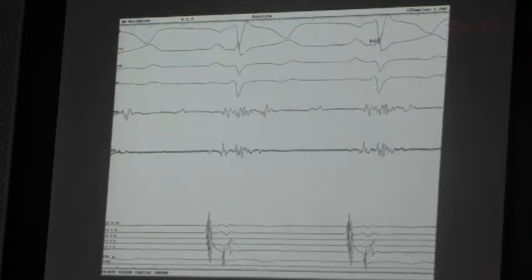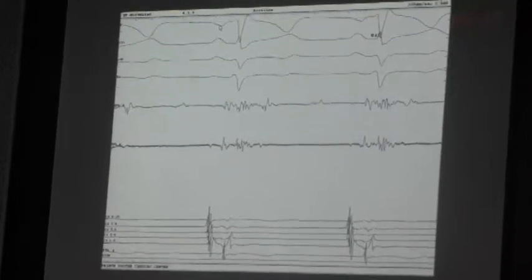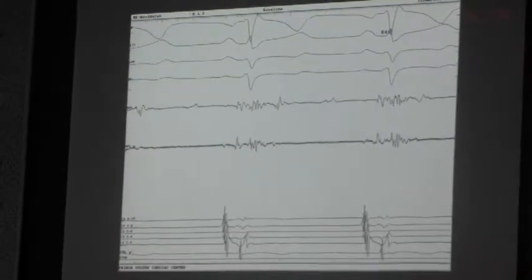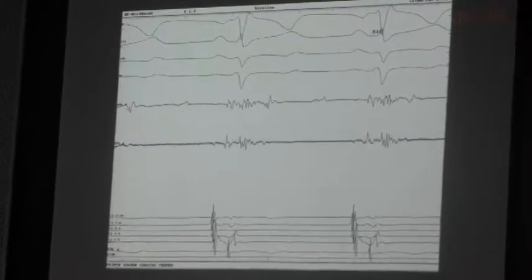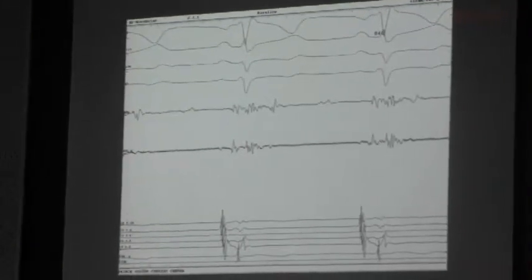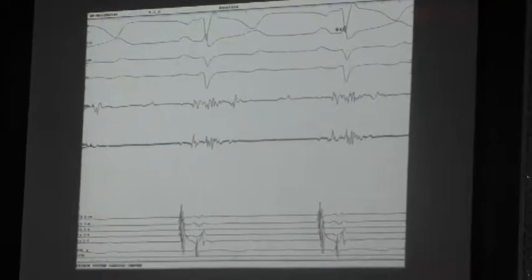One observation in this ECG tracing is that you see the P wave is inverted. This is not normal. We have a training program for the EP tech, and this is one of the intern EP techs. She reversed the arm leads, the right and left. That's why the P wave from sinus rhythm appears abnormal, and it will not be surprising to see that even the QRS morphology during VT is different.